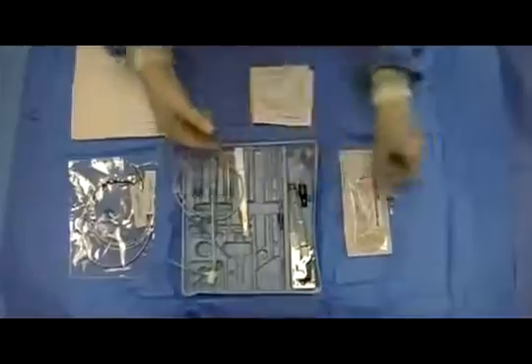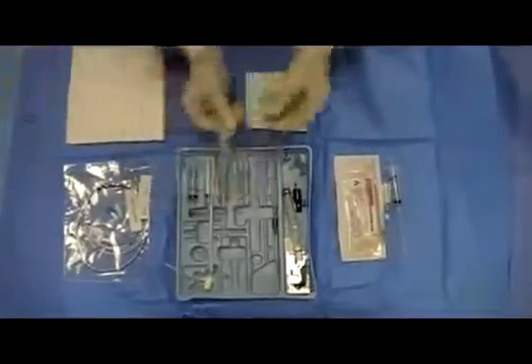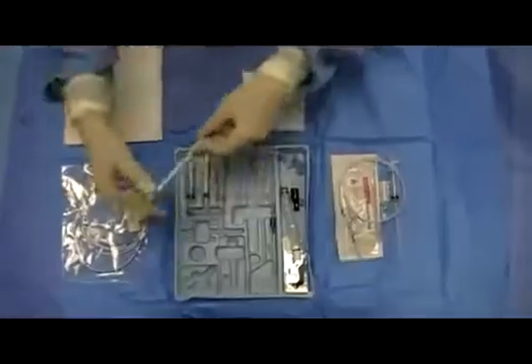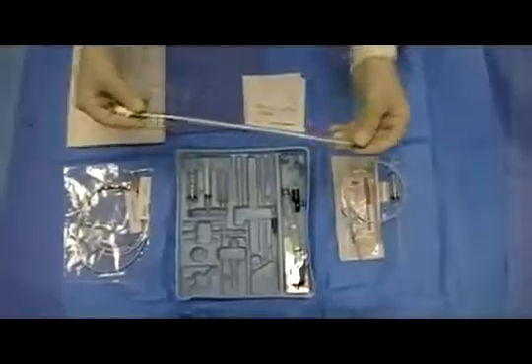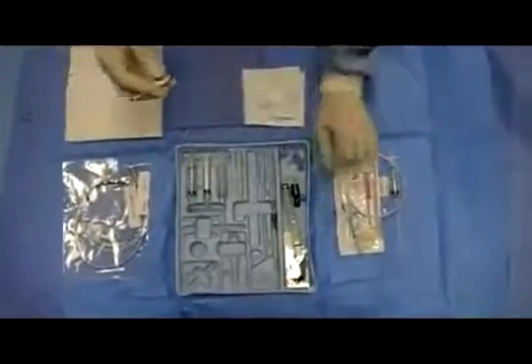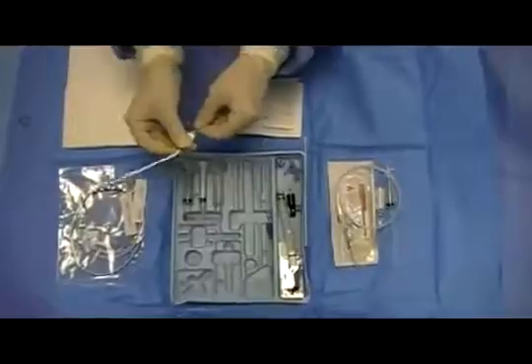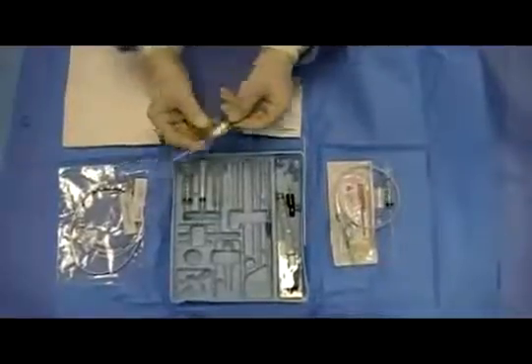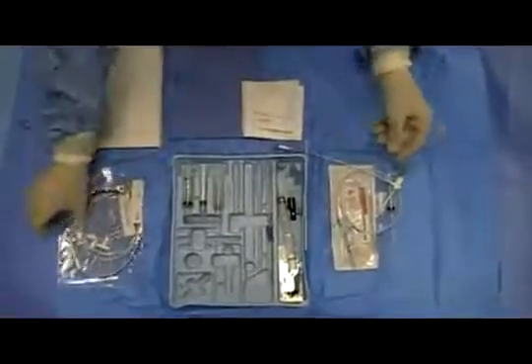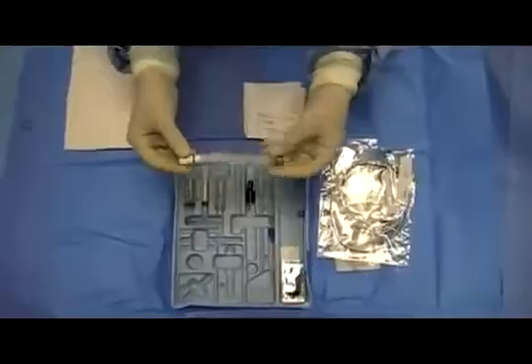The kit contains a number 11 scalpel and a guide wire. Unique to the transvenous pacer kit is the cordis catheter, along with its dilator. Thread the dilator into the cordis catheter — it will be a snug fit. This step is important to perform before gaining venous access. The kit also includes the actual pacer and sterile wires, an alligator clip, and the catheter contamination shield.